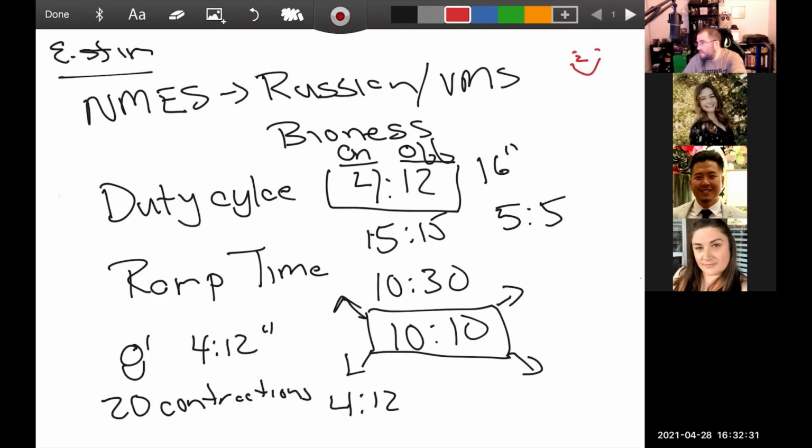And the reason she said that is because there are different neuro theories about doing 60 pulses per second versus 20 pulses per second. But that's up here, and you guys are kind of here. The machines are typically already set up at 40 pulses per second. This is one of the ones where you will use the machine default for frequency, just like with IFC, where you use a 40% scan and don't really change it. Same idea. There are high-level reasons why you change a scan, but that's beyond your level of comprehension right now.